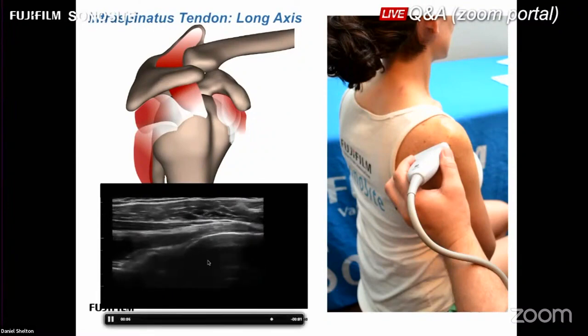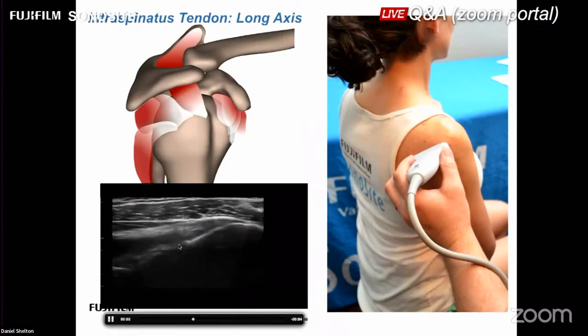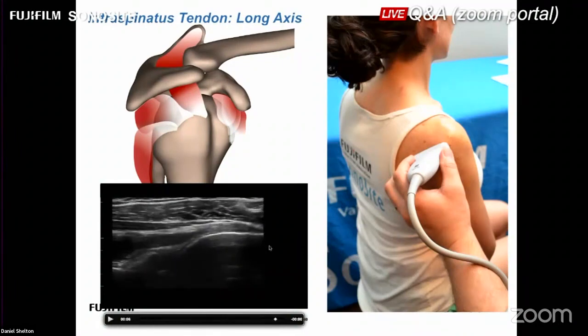When we go to live scan, I'll show you the way to get an image really nice with the bones laying flat with our ultrasound beam. But this is a good dynamic maneuver when you're trying to evaluate for joint effusions. When you externally rotate, that capsule will unfold. Whether it's filled with fluid or not, you're still going to see this little capsule unfold, and it's very nice. So internal, external rotations will help you delineate these tissue margins. Also on external rotation, there's a vein that dilates, and we'll cover that in the live scan.